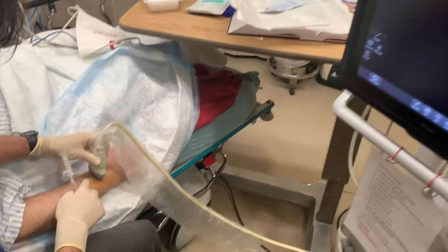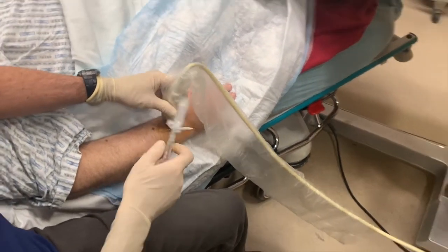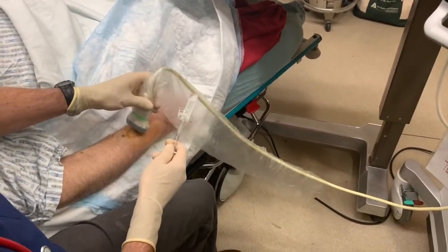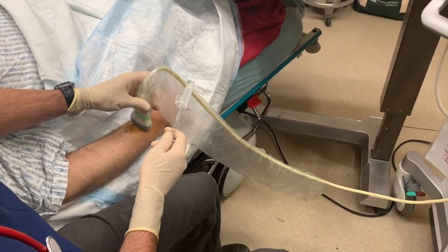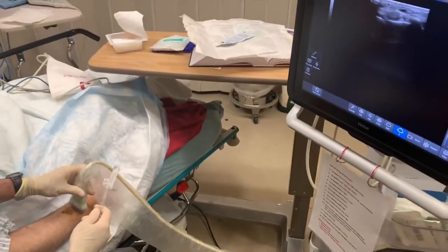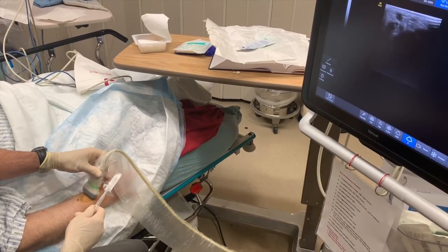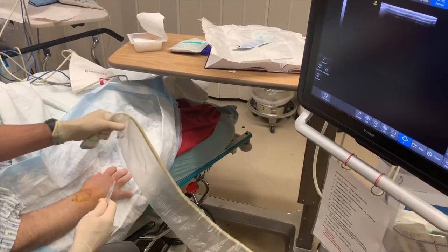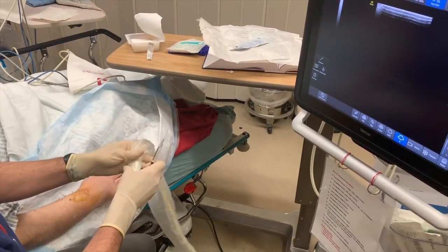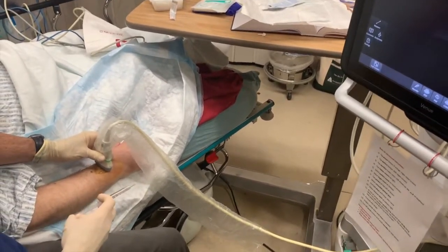Look, he's got a little mole right over where I want to go. It's perfect — very useful. This is just a little bit of lidocaine to numb it up.